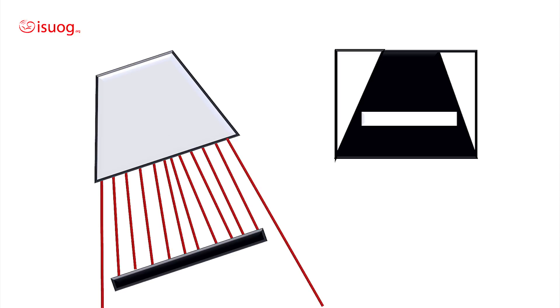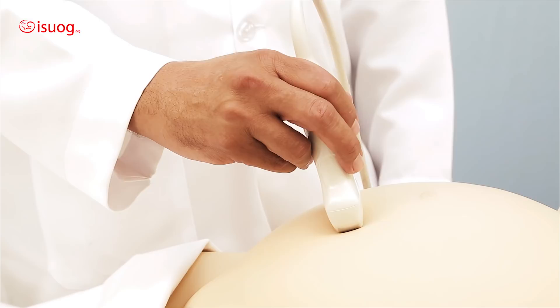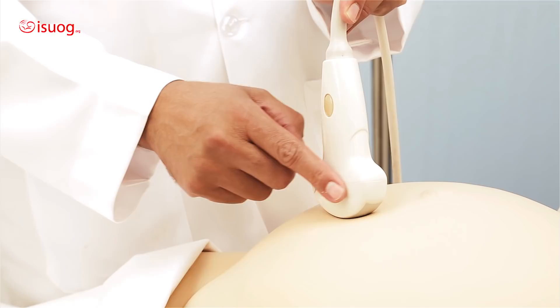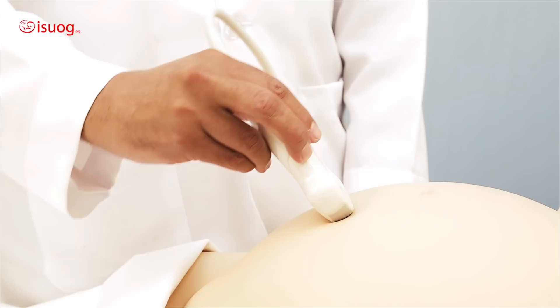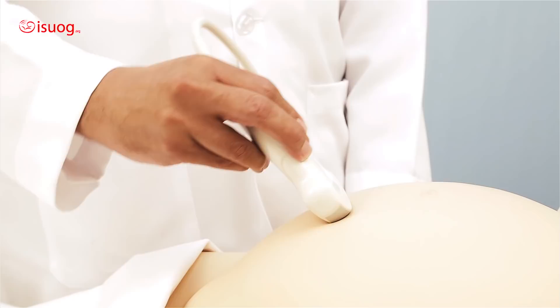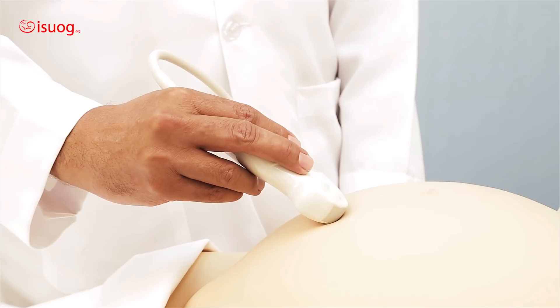The femur is now in a horizontal view and in the center of your screen. The next movement is angling. Angling is used to adjust an oblique view to a transverse view for accurate assessment and measurement of the targeted structure. Angling is leaning on the broad aspect of the probe — you can angle toward the patient's face or in the other direction. And angling is always followed by sliding on the broad axis of the probe.